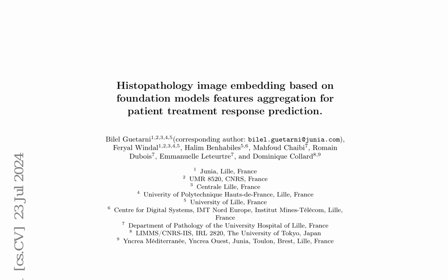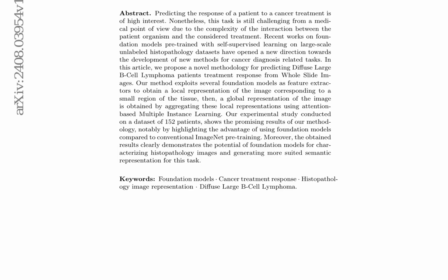multiple instance learning, MIL. This technique is chosen because only WSI patches representing tumoral or stroma tissue are relevant for predicting the response. The proposed method is distinct from recent work by Lee et al., which uses a vision transformer model exclusively trained on their own private dataset. In contrast, the proposed method produces a prediction model that is not only trained on the author's dataset but also leverages representations learned from large-scale histopathology datasets through the use of foundation models.